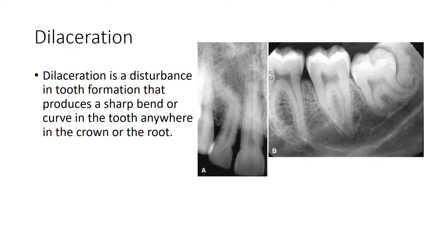Dilaceration is a disturbance in tooth formation that produces a sharp bend or curve in the tooth anywhere in the crown or the root. These are examples of a third molar and a lateral incisor showing dilaceration.